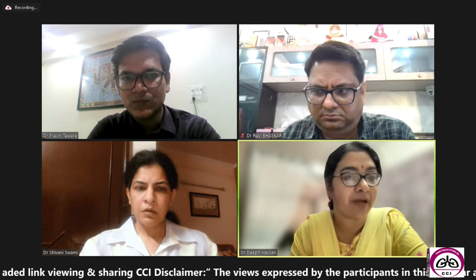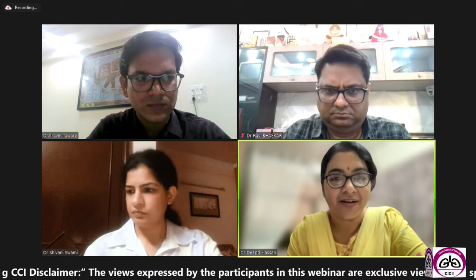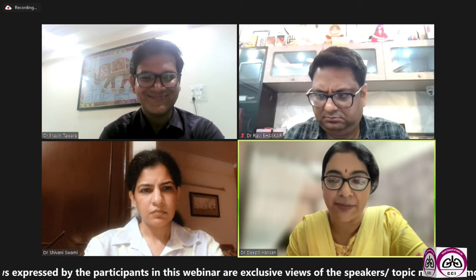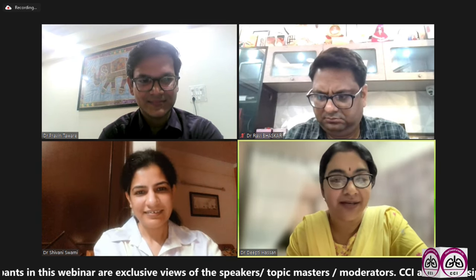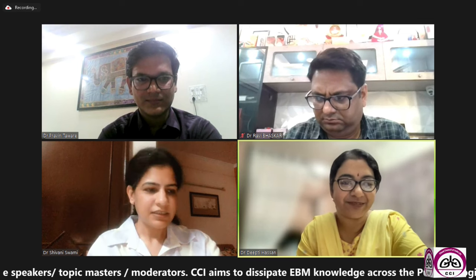Another point, if I may, Dr. Shivani: Dr. Krishna sir has a very interesting point here. Patients proudly tell us when they visit that they have a nebulizer, as if they have an elephant as a pet in their house, and that they can use it anytime. So I tell them that buying a nebulizer and when to use it are two different things. If you're settled with an MDI or a DPI, then you never even need to use it. So yes, that's important.